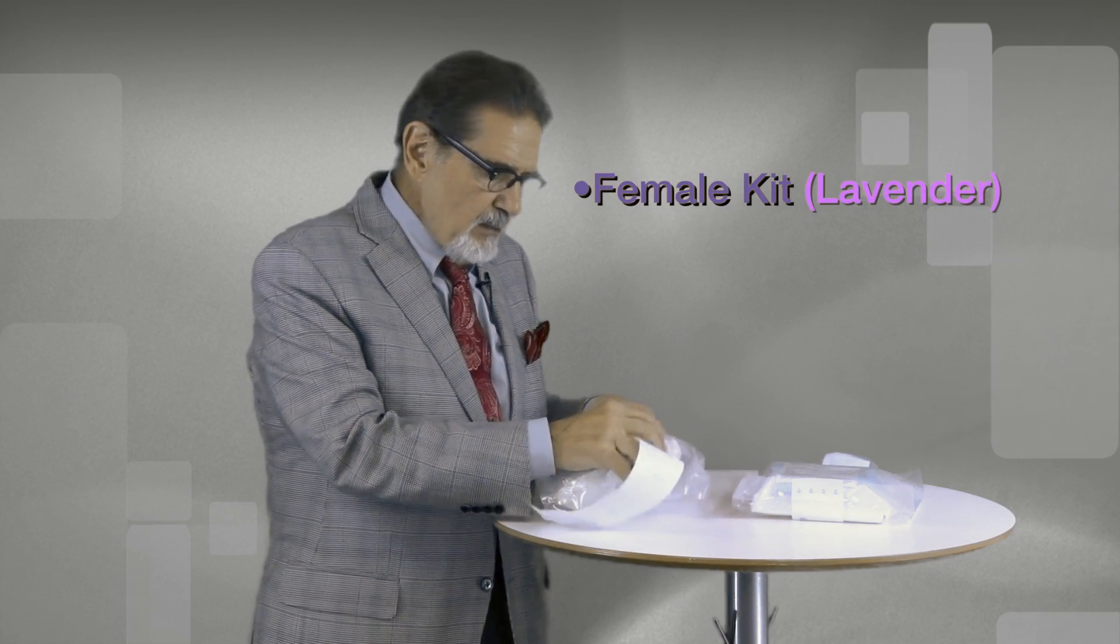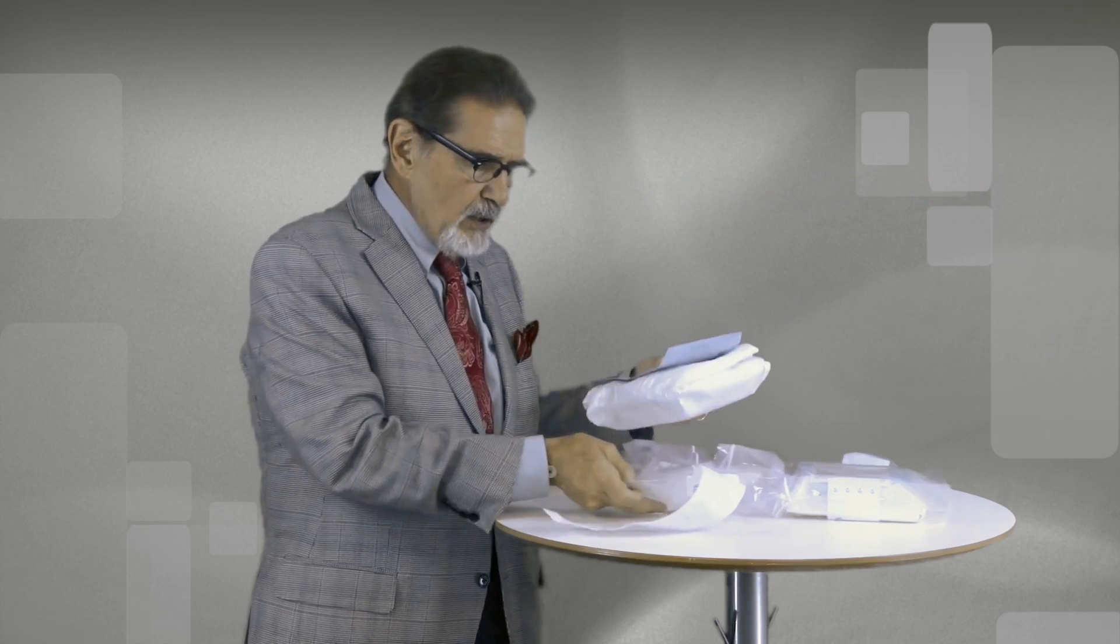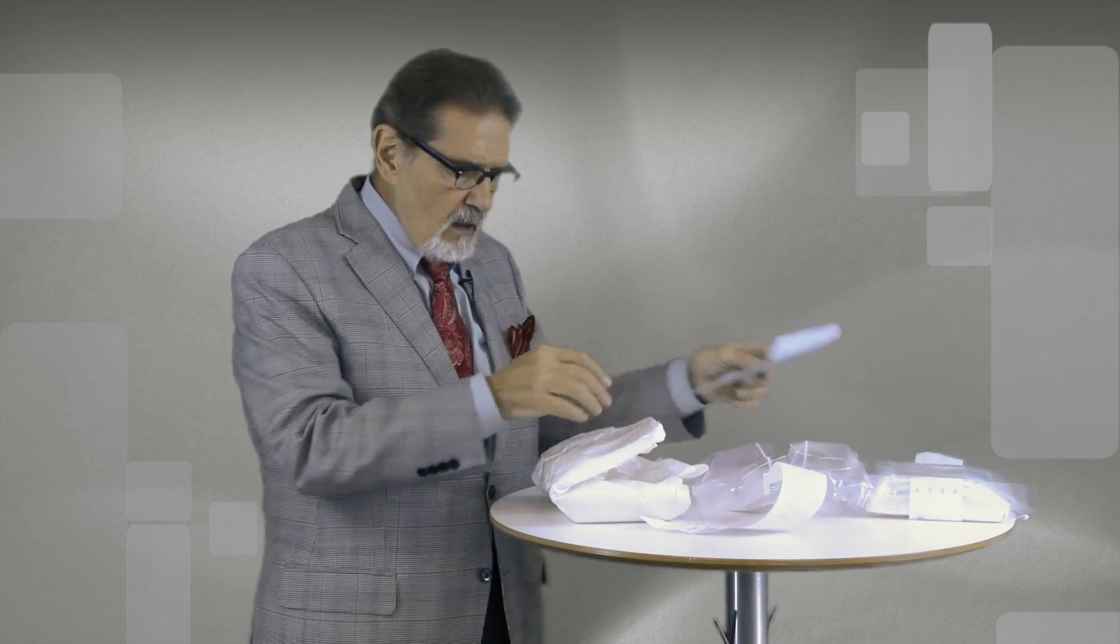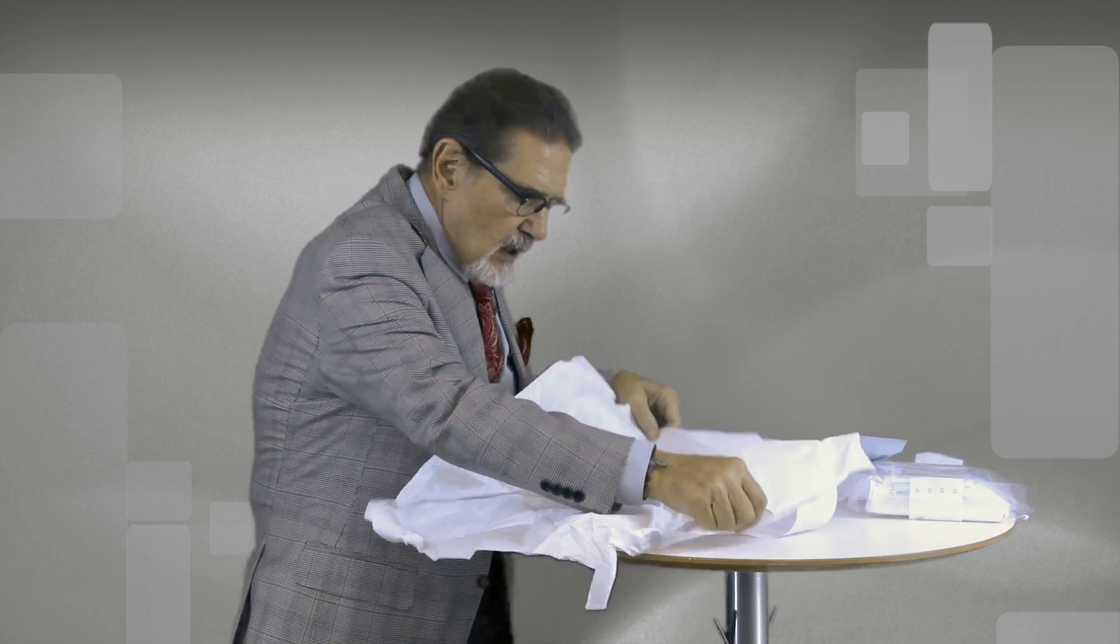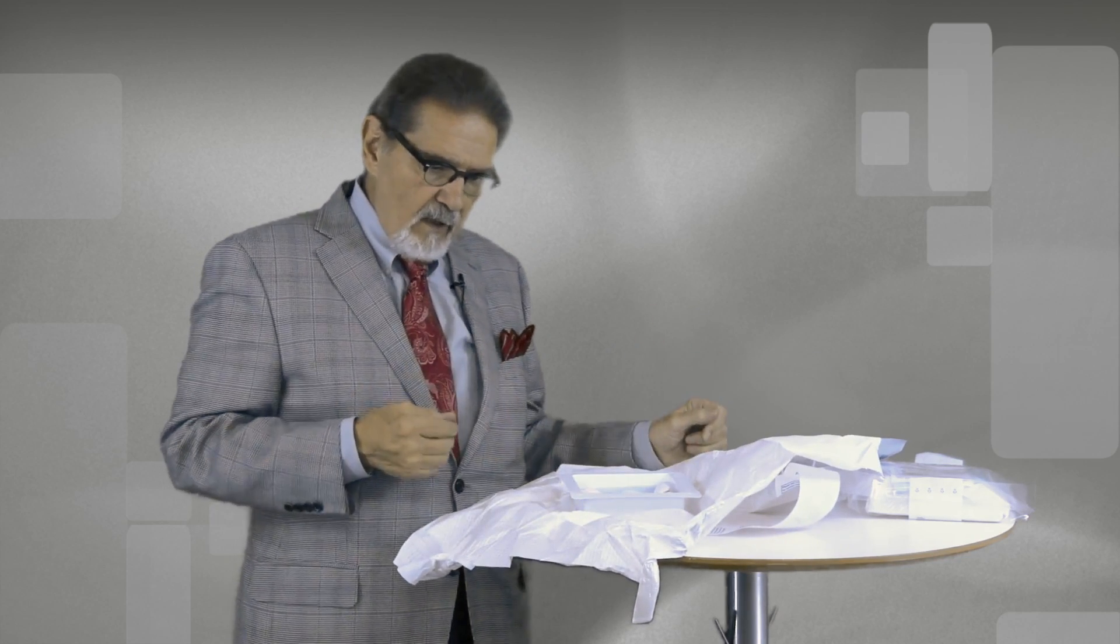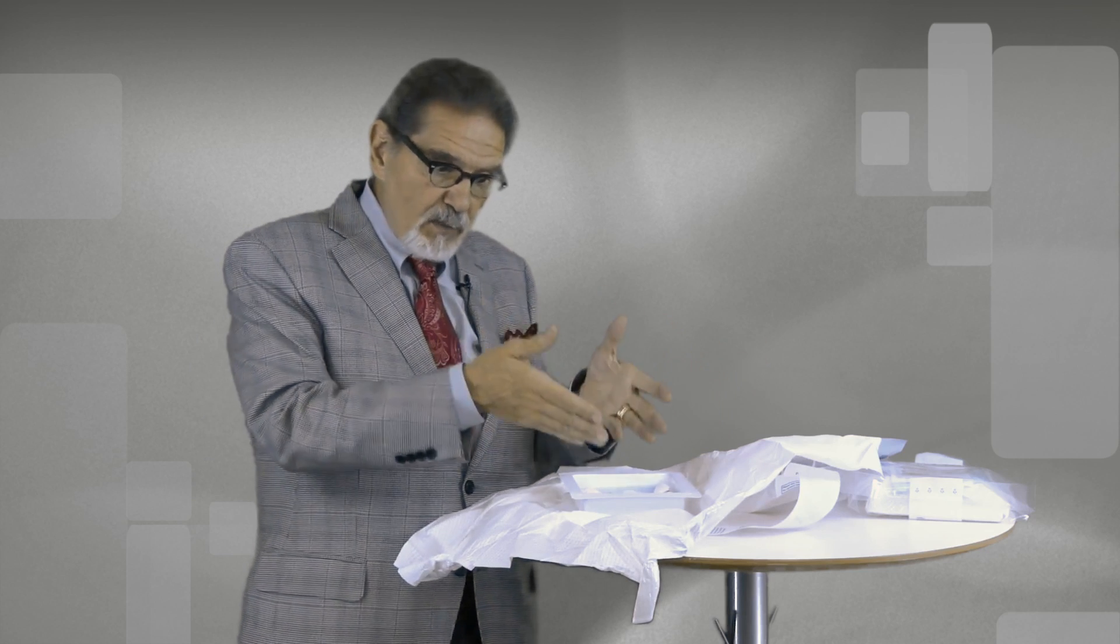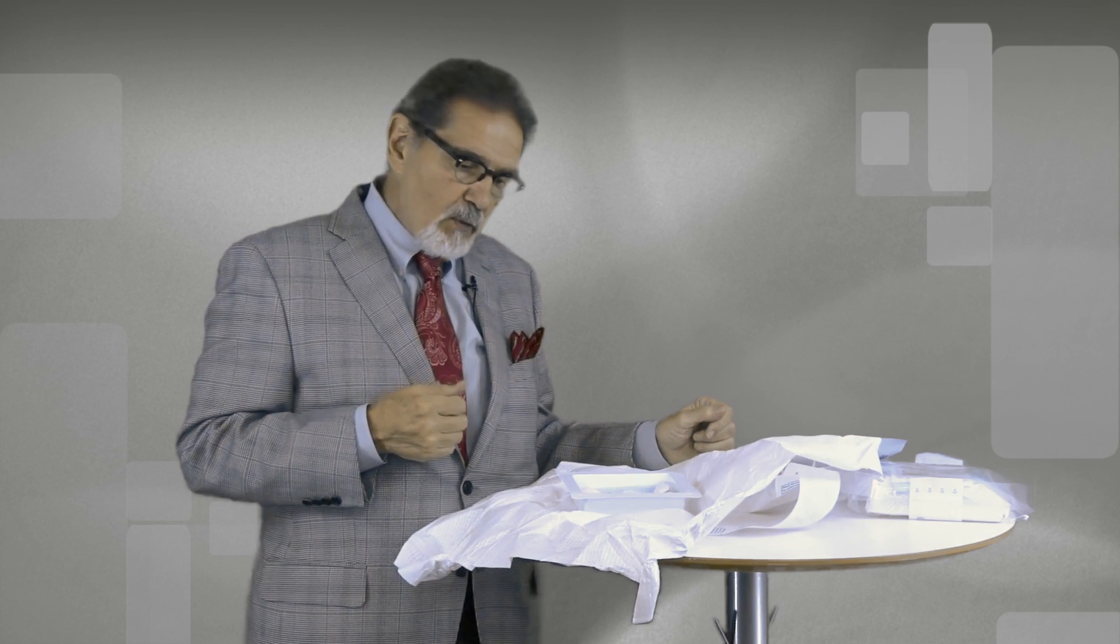As we open up the pack, I'll do the female because the male is very close to it. So once you open the pack you now have a sterile interior. And the tray, as we empty the tray, you can place your trocar, the sterile trocar within it.